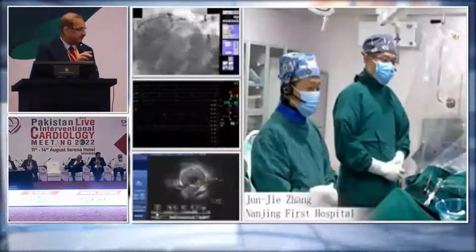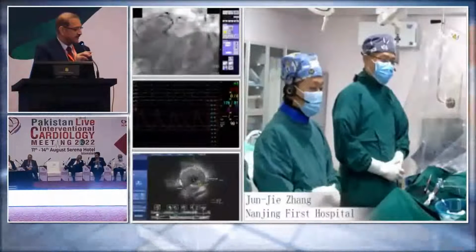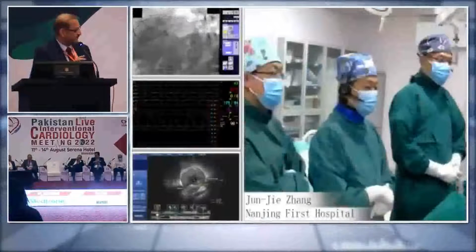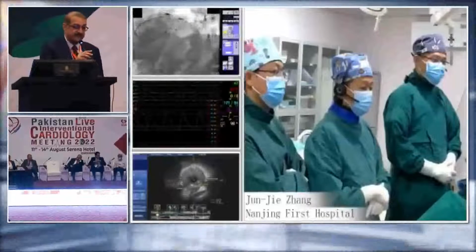And we have a panel of experts from the United States, United Kingdom, Turkey, and Pakistan. So I would also invite Professor Chen to come here and assist me in moderation. Can you please go ahead and tell us the history of the patient, please? Thank you.